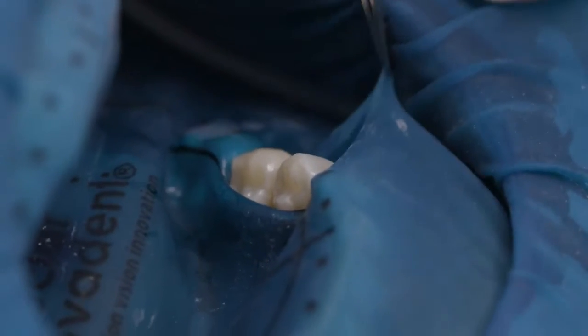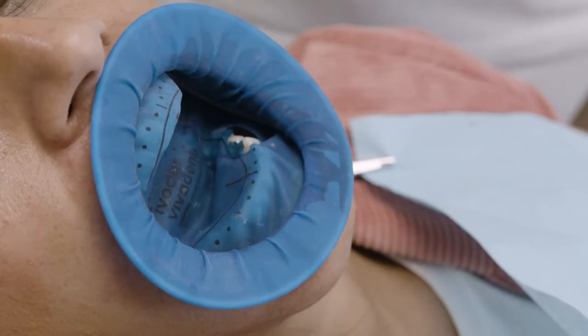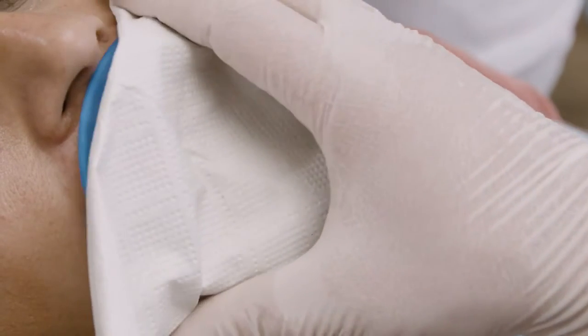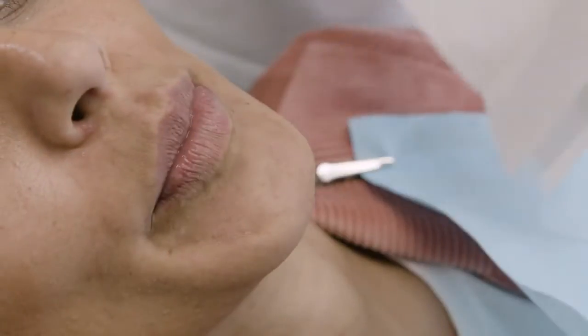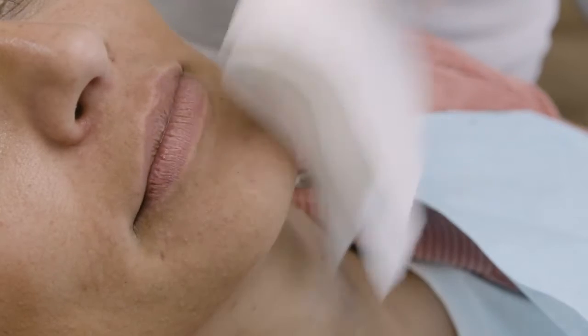Before the dam is removed, cut each septum carefully. Using a paper towel, grasp the outer ring in the lower area and lift it slightly so that the intraoral ring is loosened from the lower gingivobuccal fold. The intraoral ring can then be easily removed from the upper gingivobuccal fold and hygienically disposed of with the paper towel.